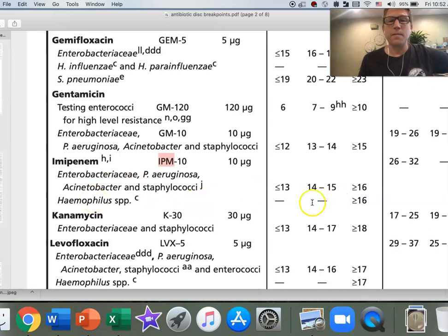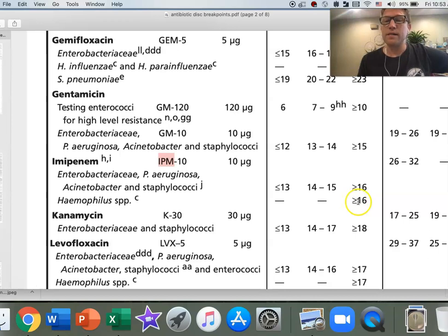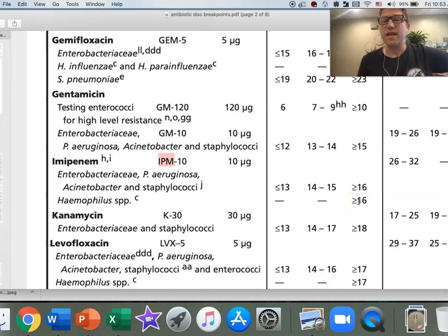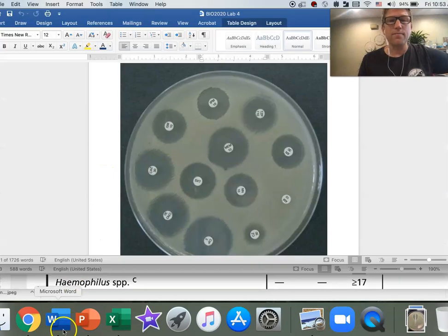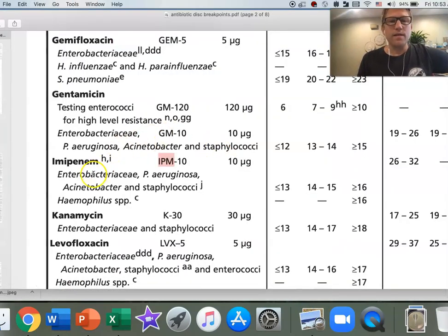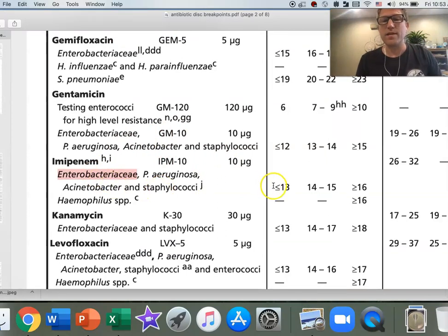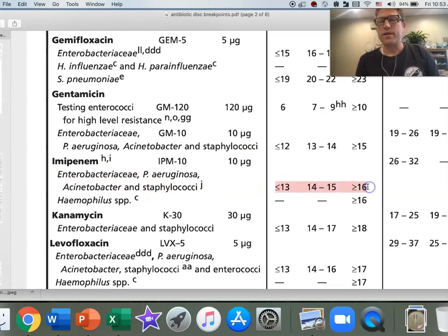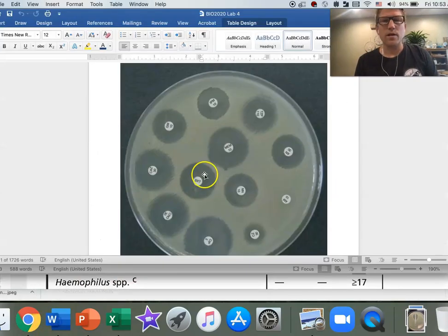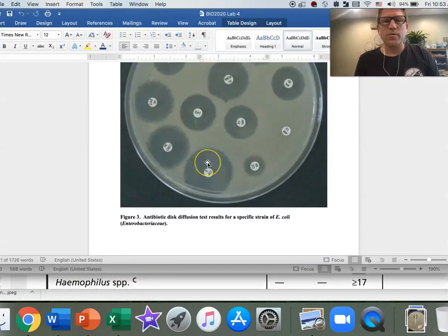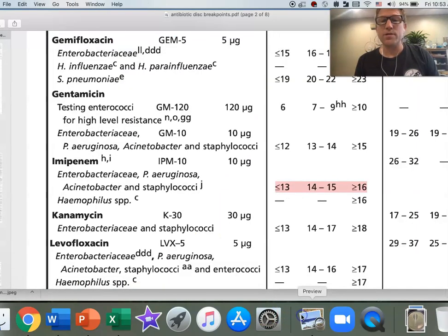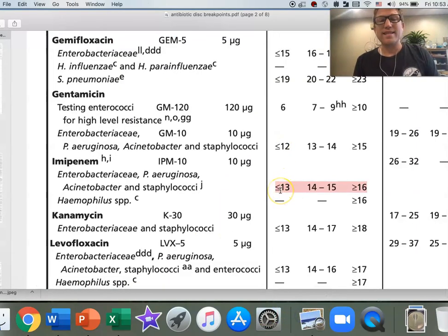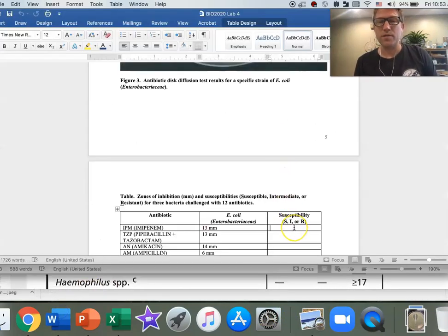For Haemophilus, which is primarily Haemophilus influenzae, if you really needed to use imipenem, you would use 16 as your breakpoint. Greater than or equal to 16, and you're going to use it. Anything less than that, forget about it. There's either no data or it's too risky. But our photo, our data back here, you're told is E. coli. And E. coli is in the Enterobacteriaceae family, which means we're going to use this set of breakpoints. Equal to or less than 13 is resistant. Greater than or equal to 16 is susceptible. Here was our diameter. We measured it. We got 13 millimeters. Equal to or less than 13 is resistant. So we would actually go back to this chart here, and under susceptibility, we would put an R for resistant.